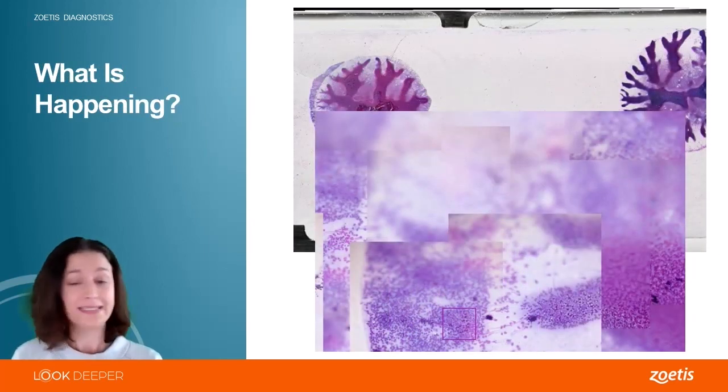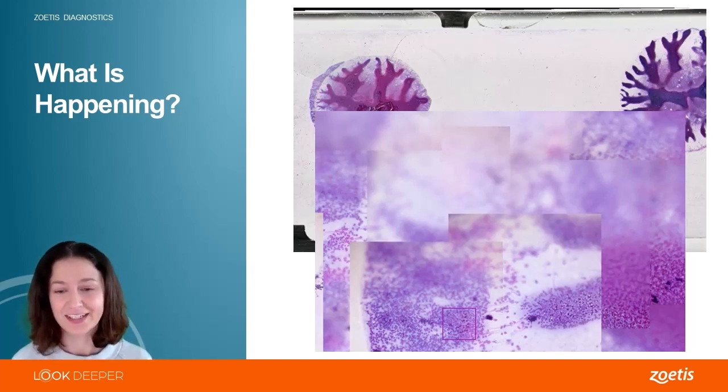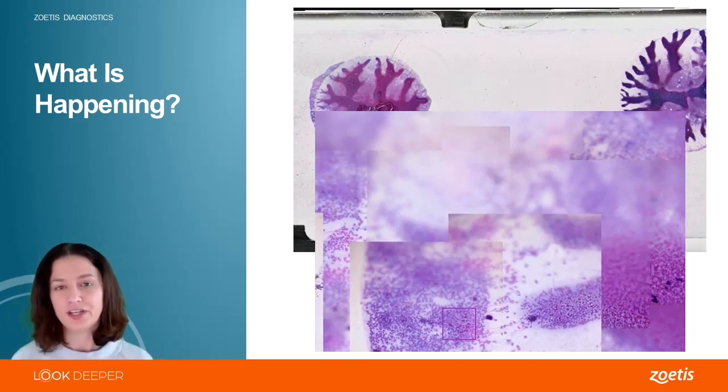Sometimes, though, what is happening? Look at this one. I've got in-focus areas, I've got blurry areas, I don't know what's happening, I've got overlapping tiles, something has gone awry here. And usually this is what happens when I either have a slide that did not get fully clipped into the stage, so it shifted a little bit, or the cover slip shifted, like it's skating over a whole bunch of oil and it's just kind of rolling back and forth, kind of on the sea of oil. So if the cover slip gets wiggly, this is what I can see.